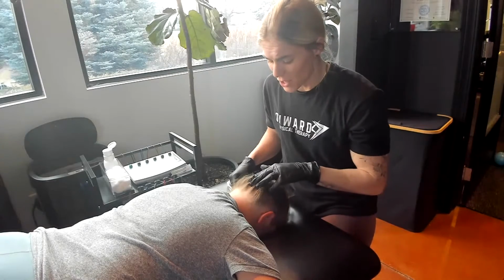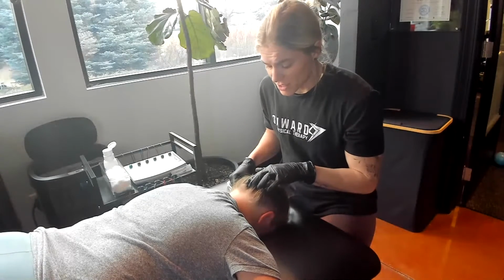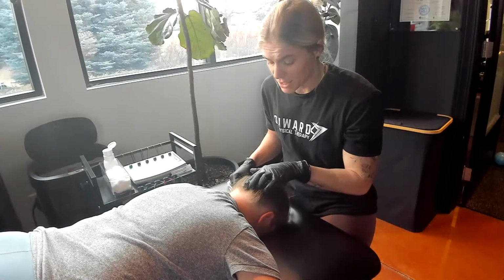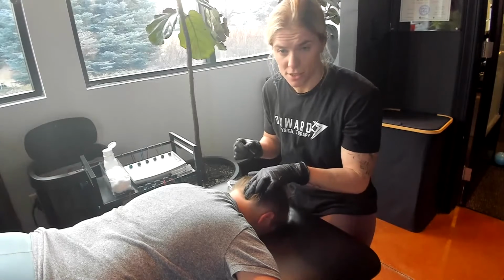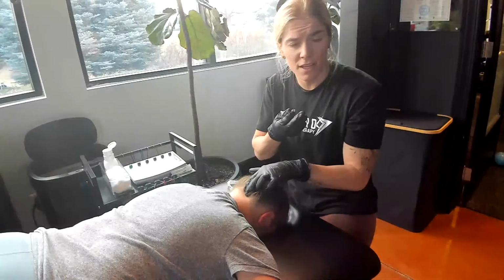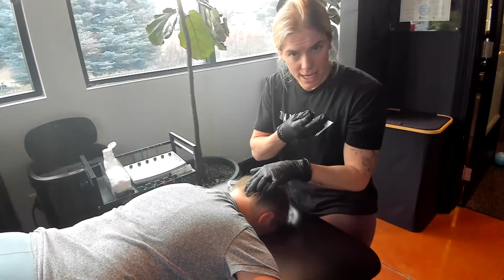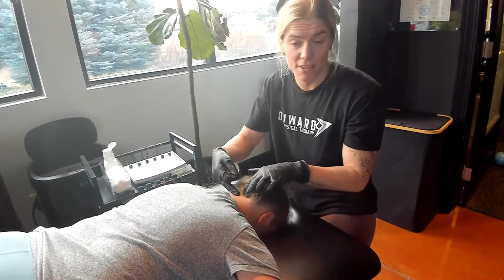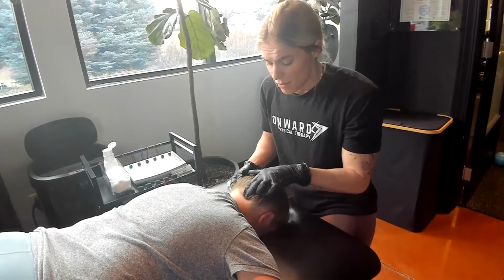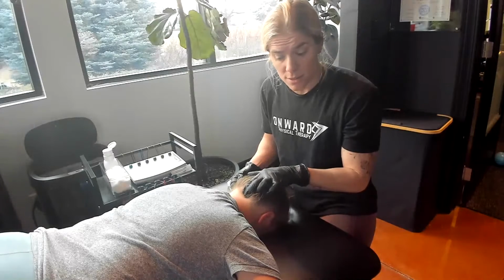Okay, so again, let's orient ourselves and we'll then start placing some needles because that's why we're here, right? So palpating external occipital protuberance, stepping just distal to that and lateral. So we're underneath that superior nuchal line. If we are at the level of the EOP, we're going to be in more tendon. So we want to be a little bit more distal between superior and inferior nuchal line. Finding that Tootsie Roll, that's going to be upper trap.